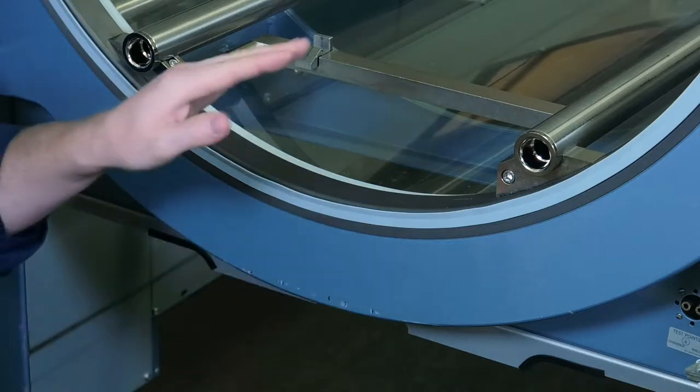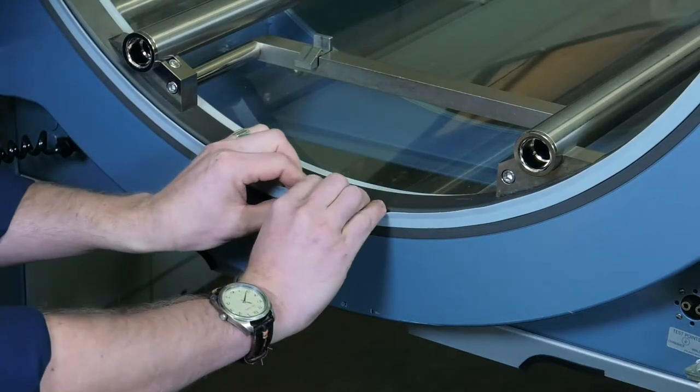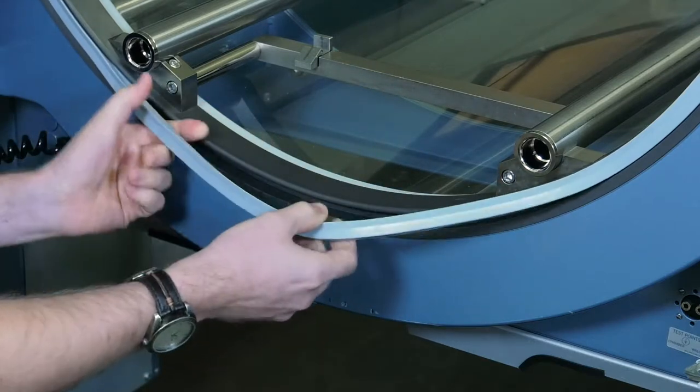Our first step is going to be to remove the old door seal. We're going to start at the 6 o'clock position, and we're going to slowly work the door seal out of the groove. Once you get it out like so, you can go ahead and just pull it out.